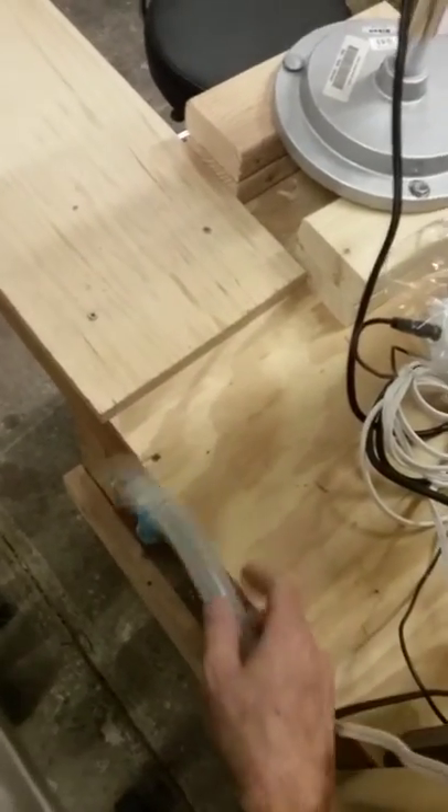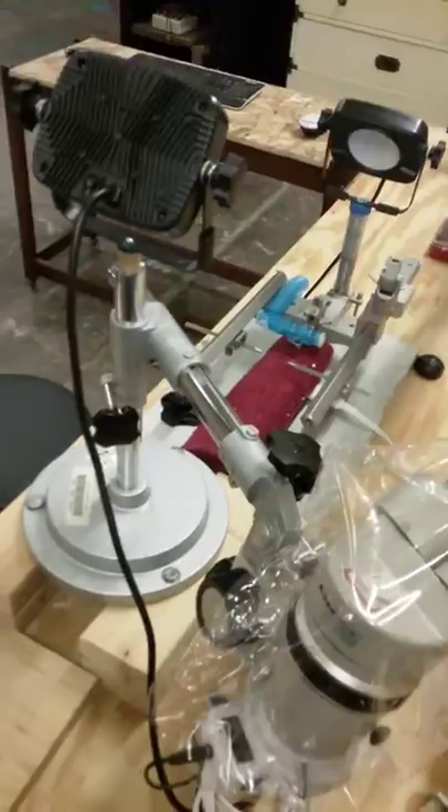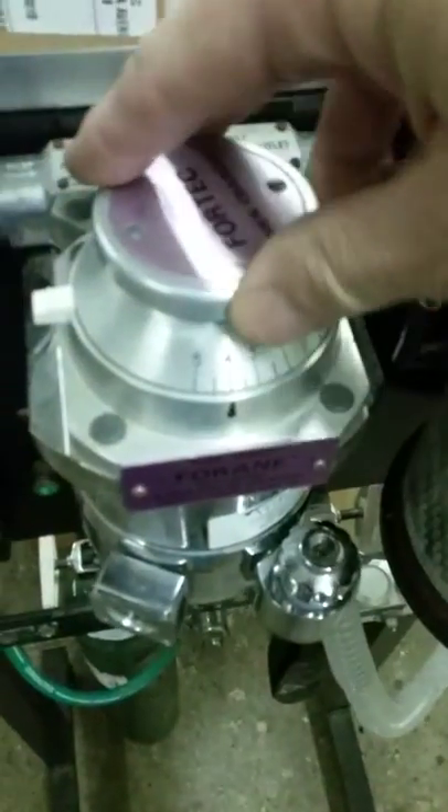When you go to take the rat out, the first thing to do is to put it into the blue connector here so that the anesthesia flows through that blue tubing underneath the table and into the nose cone.